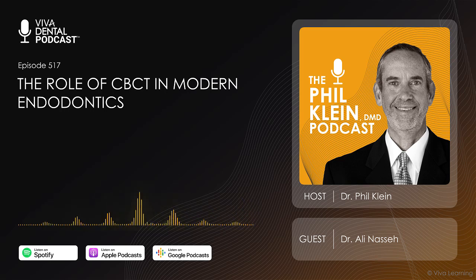and has to do with all of the pathways that roots and root canals take, the curvatures, the idiosyncrasies they have, all of the ramifications, the number of canals, none of which are obvious from looking at the tooth clinically in the oral cavity. And that's why imaging has been the cornerstone of all we do in endodontics.